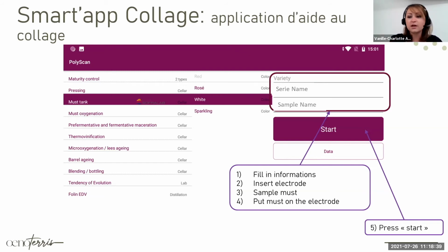So you take the electrode from the box. Then you be careful just to handle the electrodes either by the white part here or by the edges. Never put your fingers on something else. You can see it is that size. So my recommendation is take it by the edges because you have more strength to put it in place here.